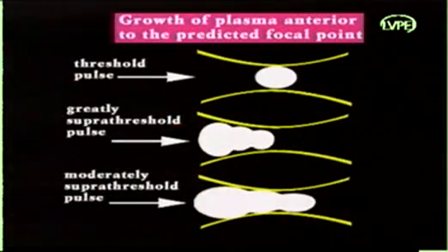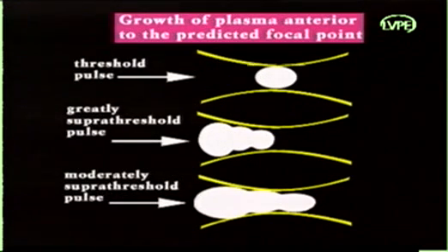The greater the energy you use, the greater the forward movement of the shock wave. Since the shock wave travels towards the surgeon from the point of focus, it is helpful to have the focal point within the iris stroma. For this, one has to focus the laser beam precisely on the surface of the iris and then use the posterior offset option, making it converge 0.1 mm in the iris stroma. The endpoint of the procedure is the mushrooming of the pigment into the anterior chamber.